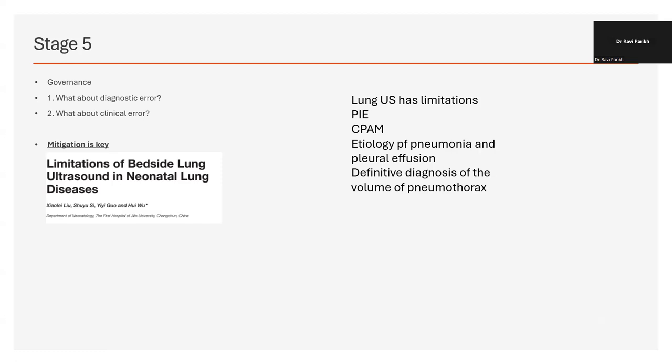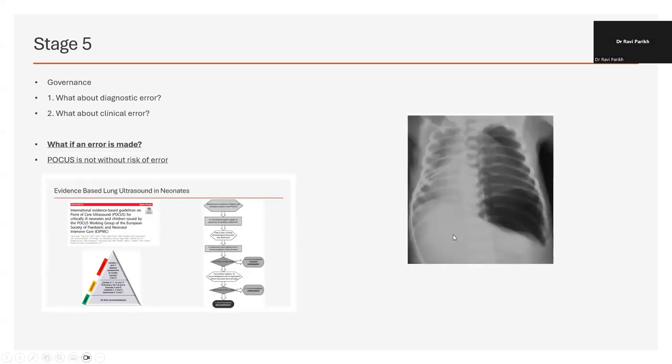But be aware that really you might have a problem with a pneumothorax that's originating posteriorly. And sometimes in situations like that, depending on the baby's position, if the baby is really left side down, the air tends to localize to the right side up region. And if you then do an anterior scan with the baby left side down, that will change, and that can really confuse your diagnosis. So my experience always is that when I'm doing a diagnostic ultrasound for a pneumothorax, I like the baby to be supine as far as possible, and I'm going to do an anterior lateral scan if I want to quantify it.